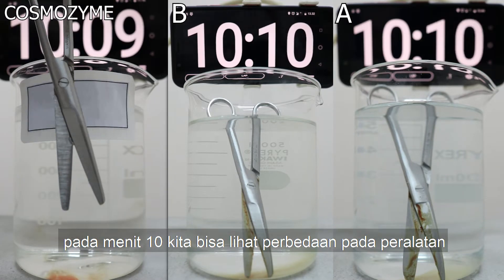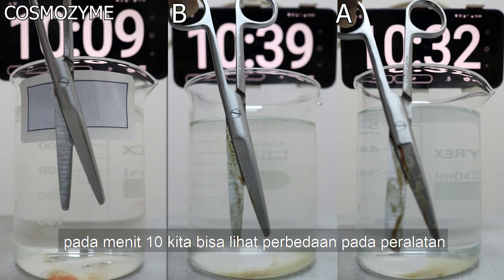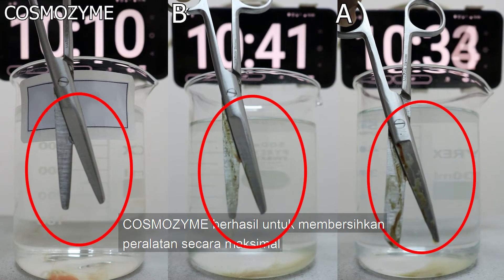In ten minutes, the exam shows the blood has dissolved perfectly from the surgical instrument. Unlike the other products, the stain still remains. We can see the difference.